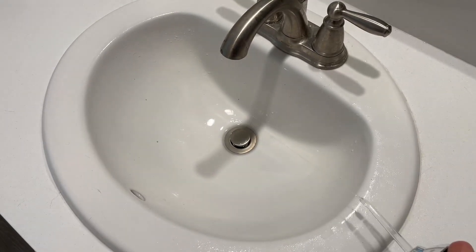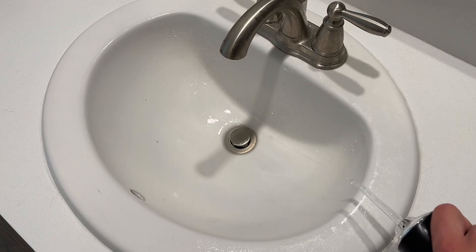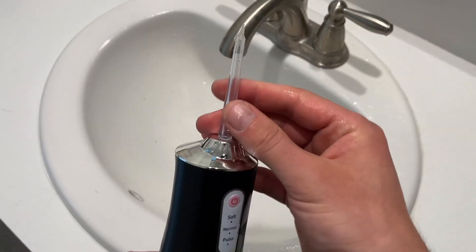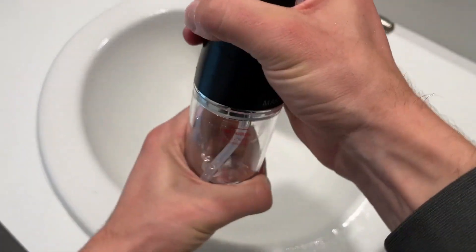Because of the nozzle design, which is extremely small, it builds up a lot of pressure as the water narrows to such a small point. It's extremely easy to clean, remove, and replace the tips — you just wiggle it out and twist it in and out.